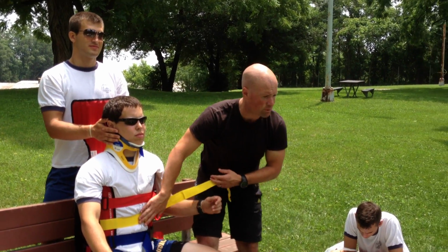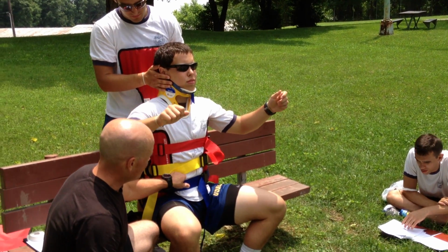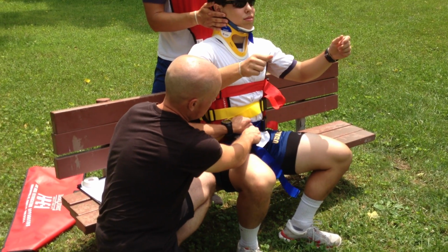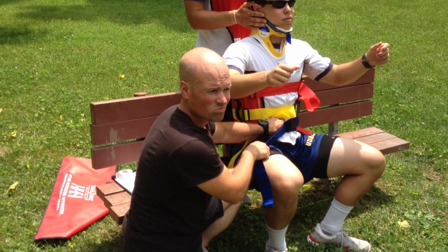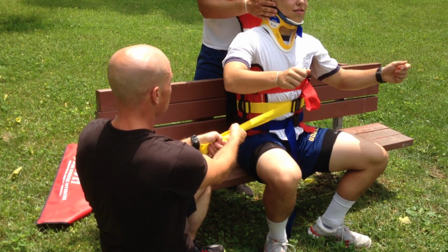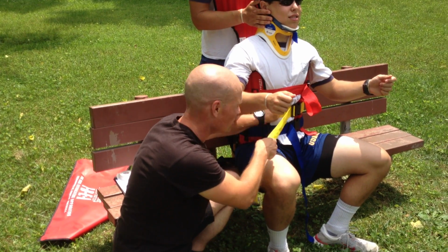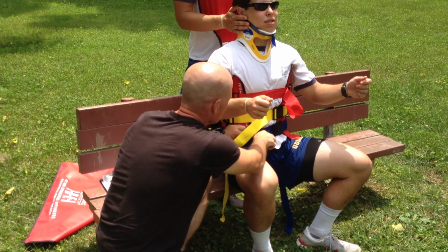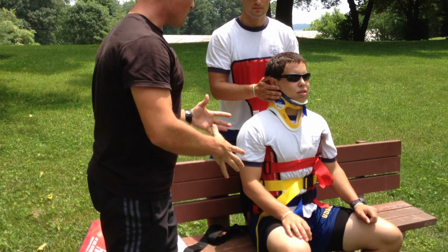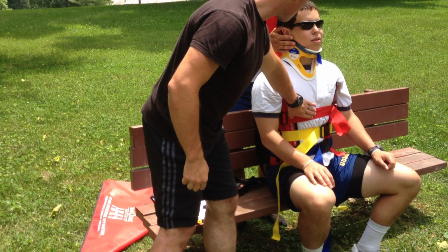Meanwhile, down here, this bottom and middle, I'm going to crank on this a little bit. And the best way to do that is to push and pull at the same time. That's better. I mean, watch this. Did the spine jiggle? It did not jiggle. Some of you are going to go like this. That's not good. So just push and pull. All right? And I want this to be firm enough that it is going to start to give that corset effect, squeezing in all of that tissue to hold the spine in a nice column. You can still breathe though, sir.